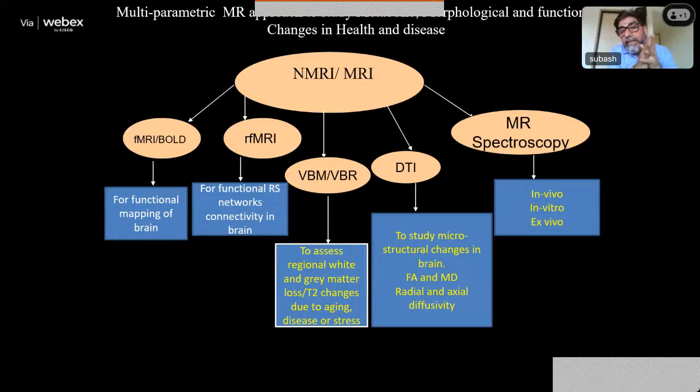Then you can use DTI or diffusion imaging techniques to look at the diffusion processes which are happening in a tissue, and when the disease sets in, the diffusion patterns change in the diseased tissue, which you can measure using diffusion weighted imaging. It has a very excellent application in detection of brain stroke, which is otherwise not possible to diagnose within a short period of onset of the stroke.